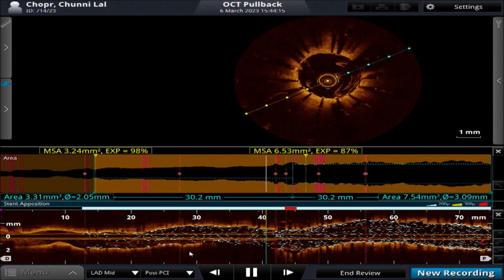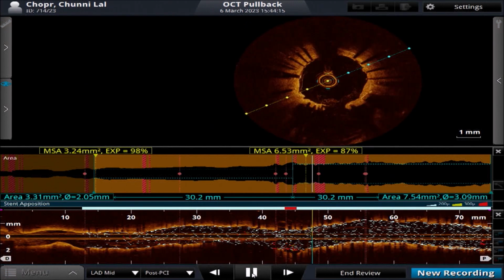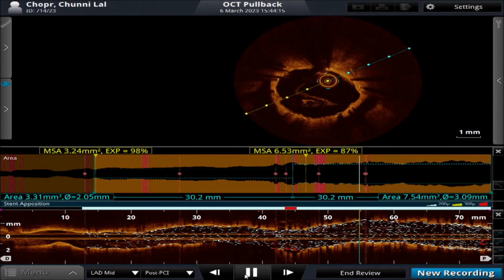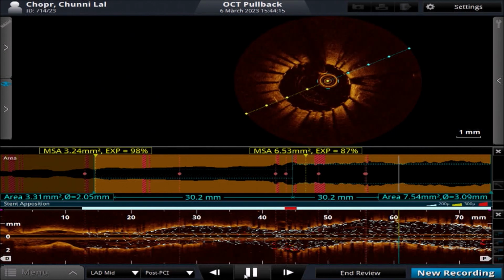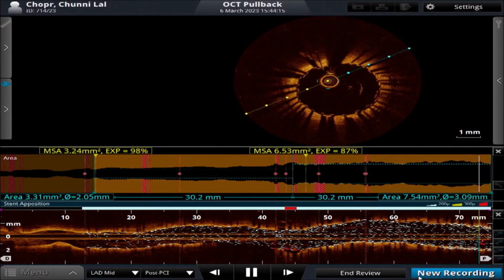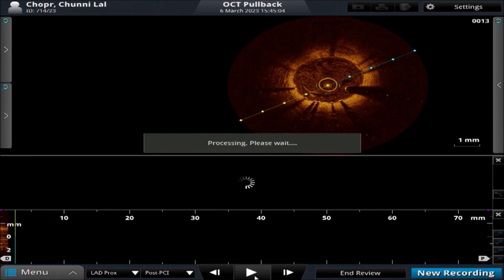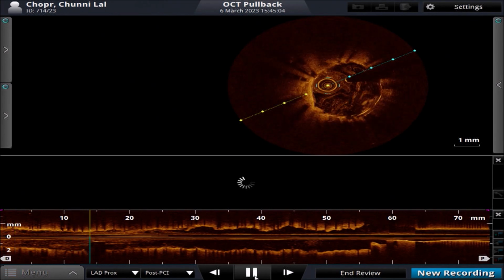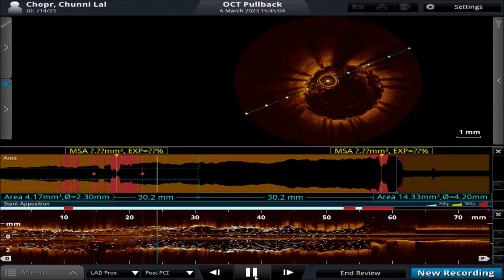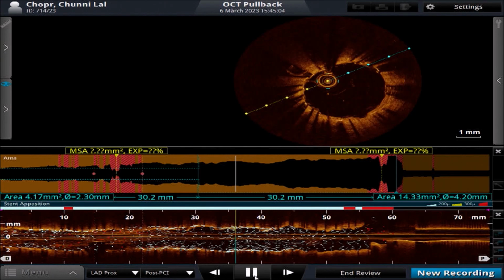Okay. Can you stop where we are going to have the aneurysm? So this is okay, and now it's a 3.5 millimeter stent, and this is the aneurysmal segment. This is the proximal part which is well dilated, expanded, and well apposed. Second run, and the expansion is how much percentage in the distal to mid LAD? So more than 90 is very well acceptable, and this is the run proximal to the ostial LAD, which was 3.5 dilated with the 4. Proximally it's a 4, and this is the overlap segment.